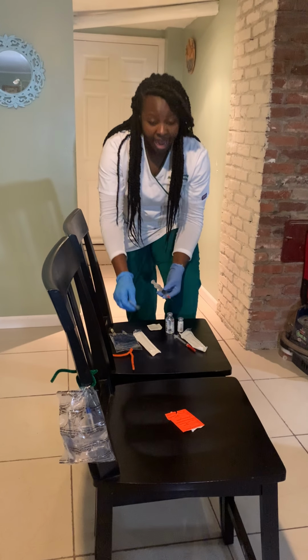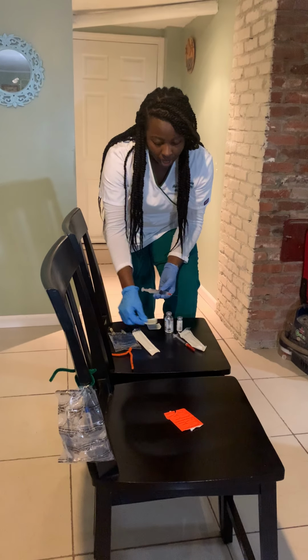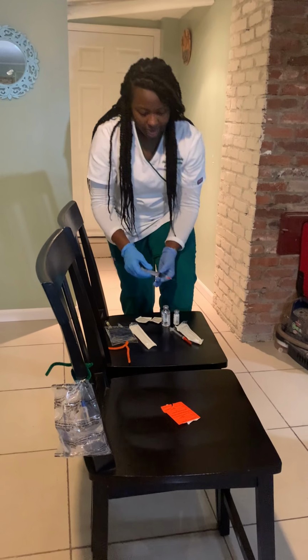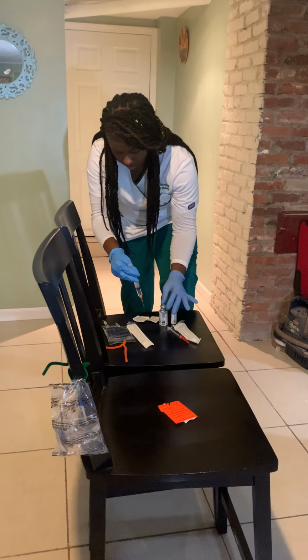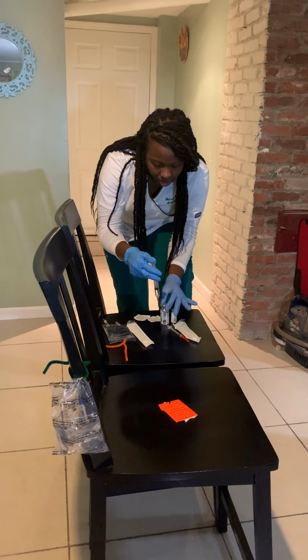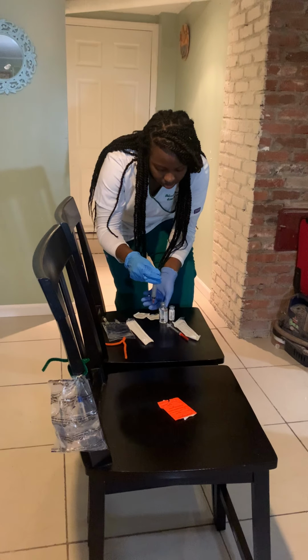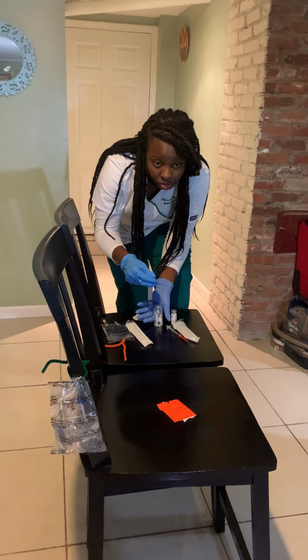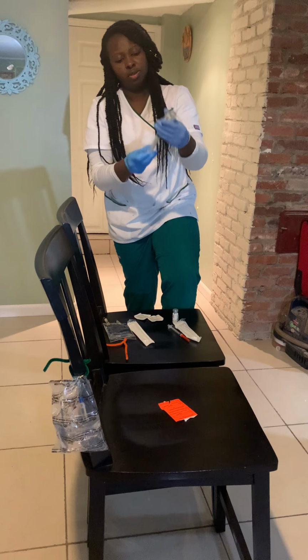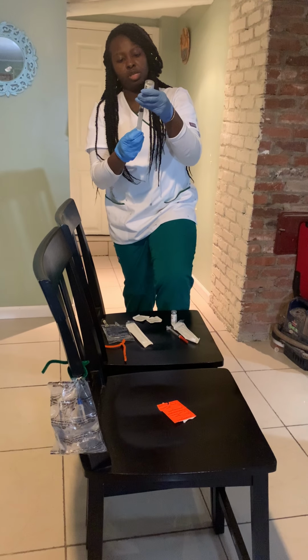Before I start, I'm going to perform aseptic technique separately. Now I'm going to insert the air. All right, so I'm going to pull in the correct amount of solution.